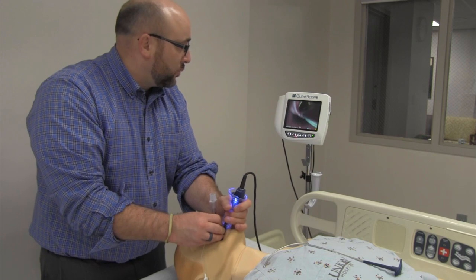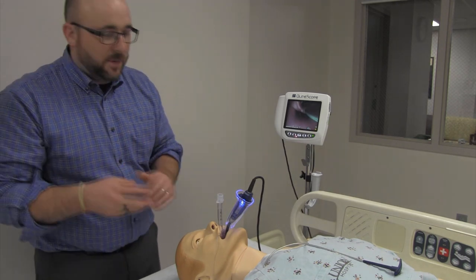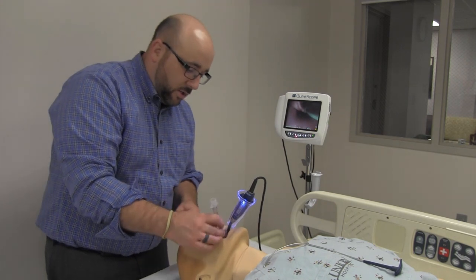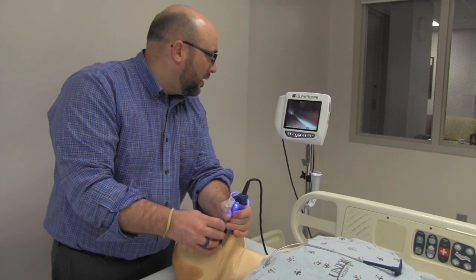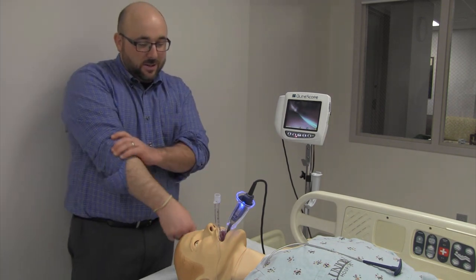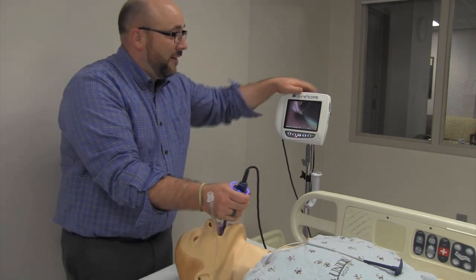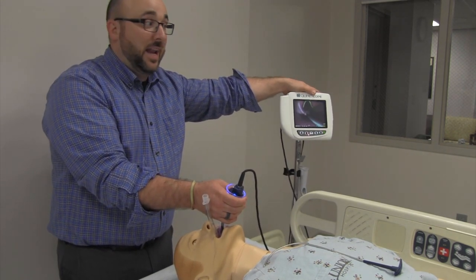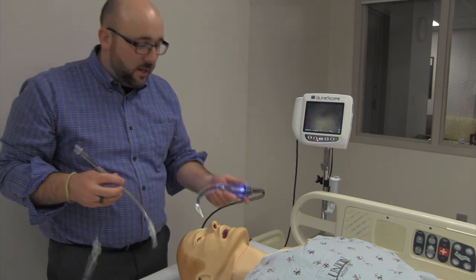One cool thing: if someone in the room asks for the depth, you can look at the monitor and report it — for example, 24 at the gum line and 11 at the cords. You can actually see how deep it is at the cords. The great thing about this is that everybody in the room can see the endotracheal tube is in the right spot. You have many other verification methods, but you can see it's correct and everybody else does too — they feel confident in your intubation.